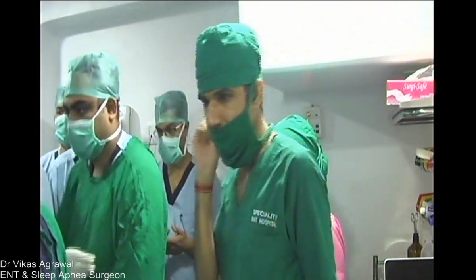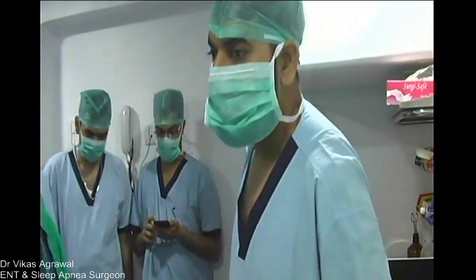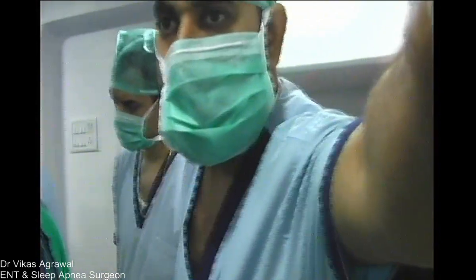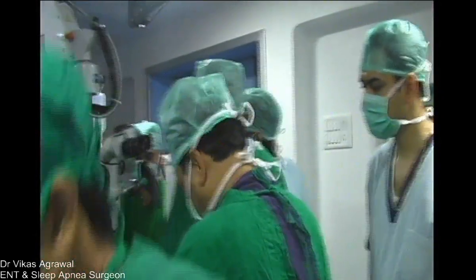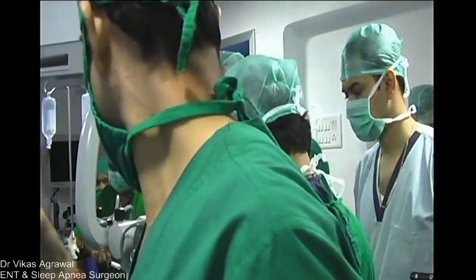Okay. I am really sorry for the delay, but you understand that this much time goes in inducing a patient and preparing. So we are now ready with it. Can we put the microscopic picture into the system?